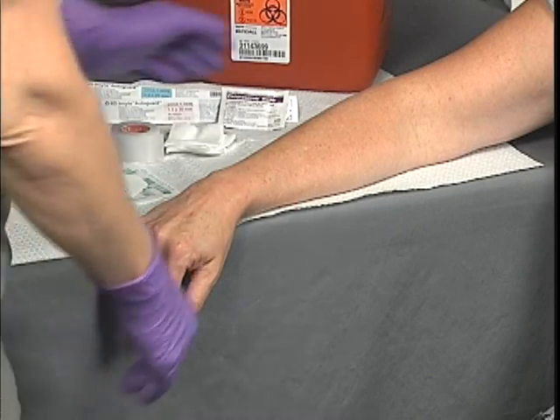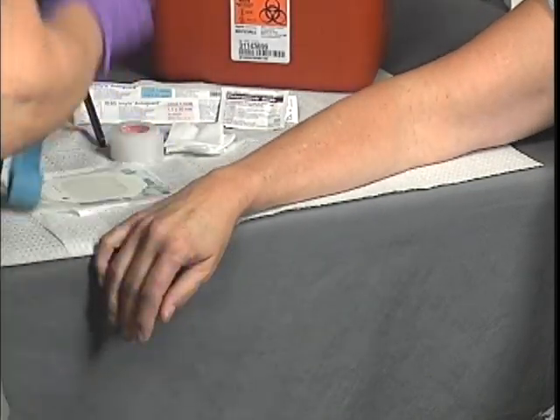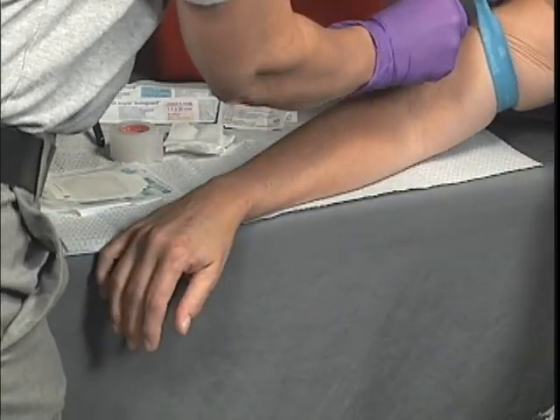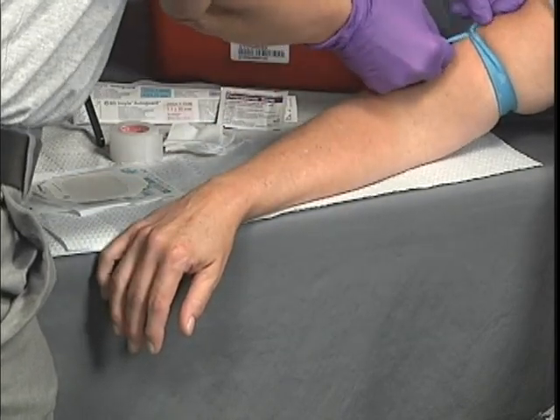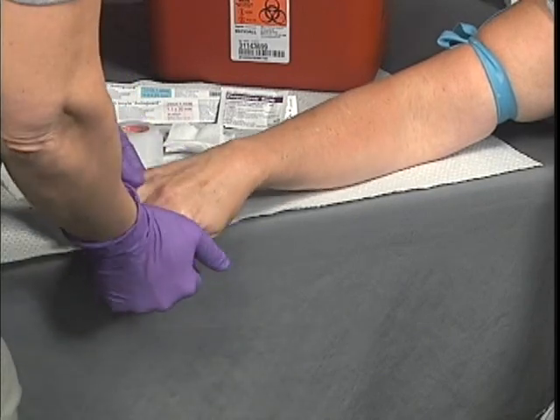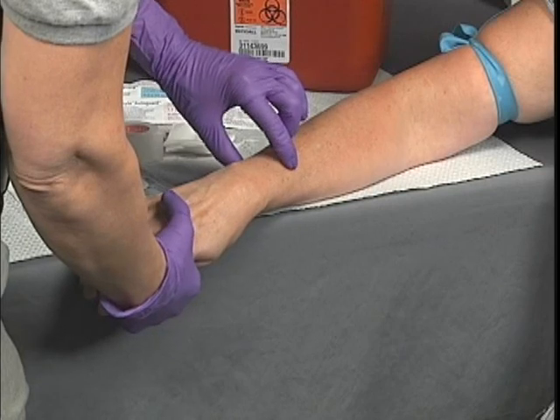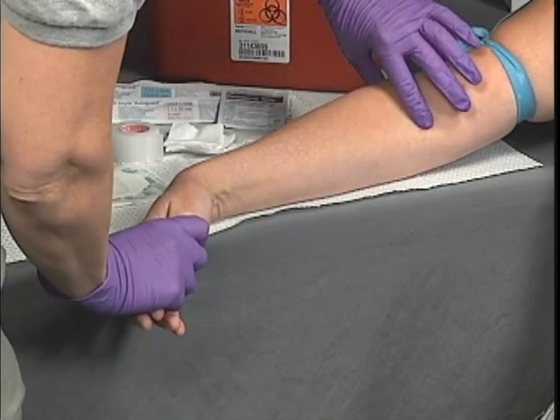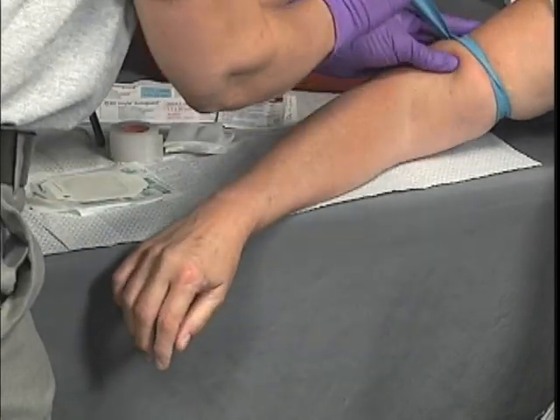Selecting a venipuncture area usually involves the hand, wrist, forearm, or antecubital space. Inspect it for contraindications for venipuncture. Applying a venous tourniquet may help facilitate finding the appropriate site. When selecting a vein for cannulation, it may help to reapply the venous tourniquet approximately four to eight inches above the selected area.